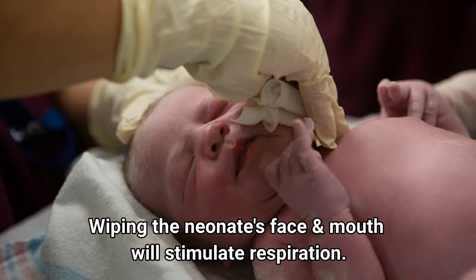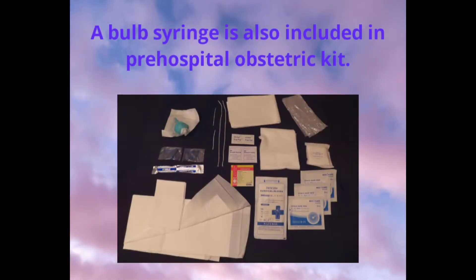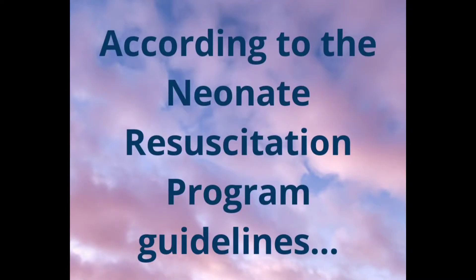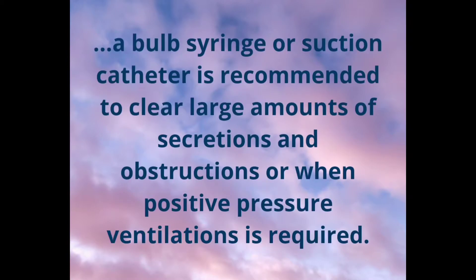Wiping the neonate's face and mouth will stimulate respiration. A bulb syringe is also included in the pre-hospital obstetric kit — don't toss it out just yet. According to the neonatal resuscitation program guidelines, a bulb syringe or suction catheter is recommended to clear large amounts of secretions and obstructions, or when positive pressure ventilation is required.